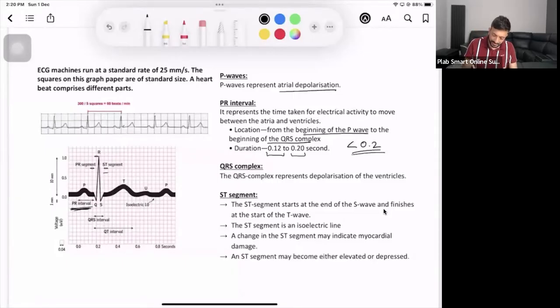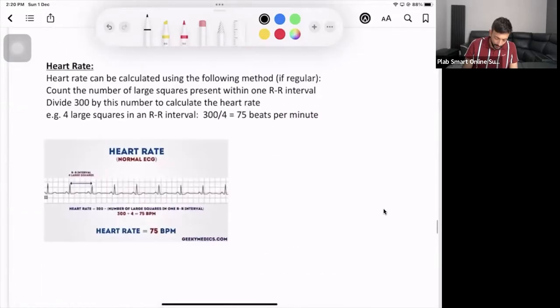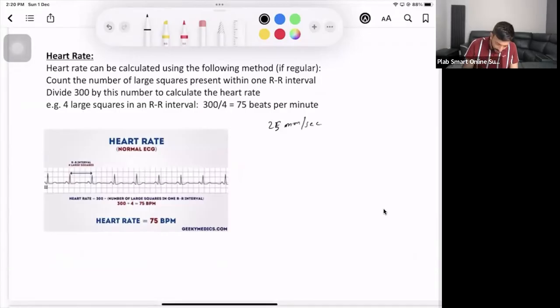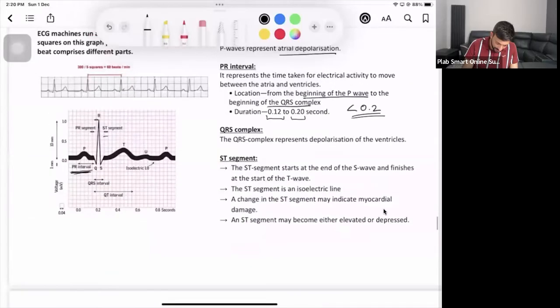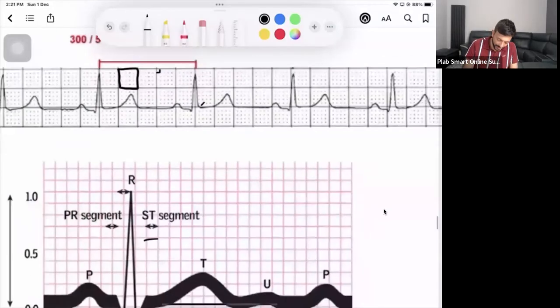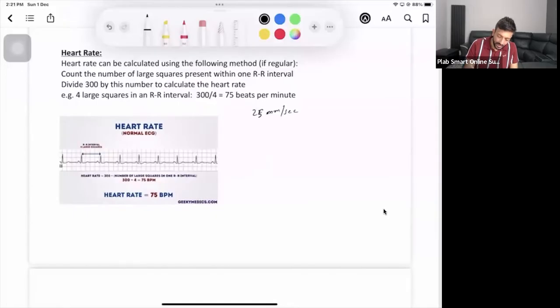You can also explain the ST segment. The ECG runs at 25 mm per second. On the ECG paper there are big boxes, and each big box contains smaller boxes. One big box takes 0.2 seconds; one small box takes 0.04 seconds.